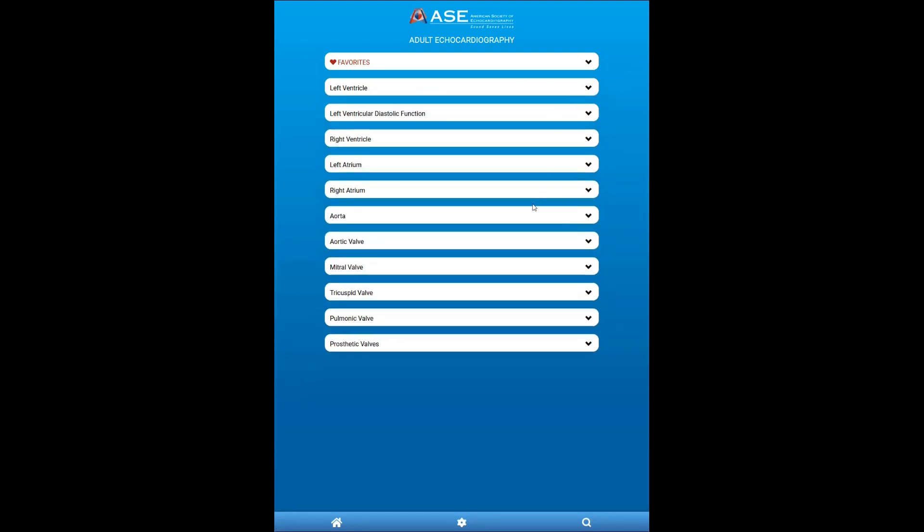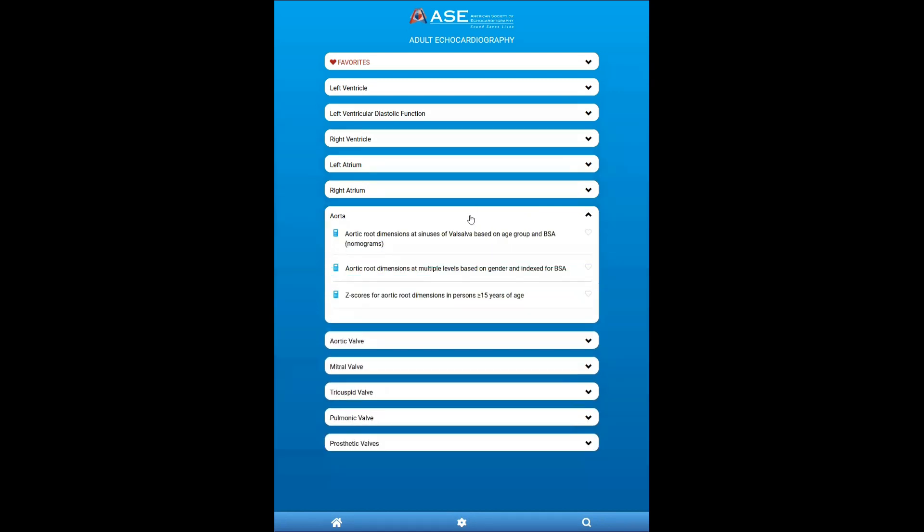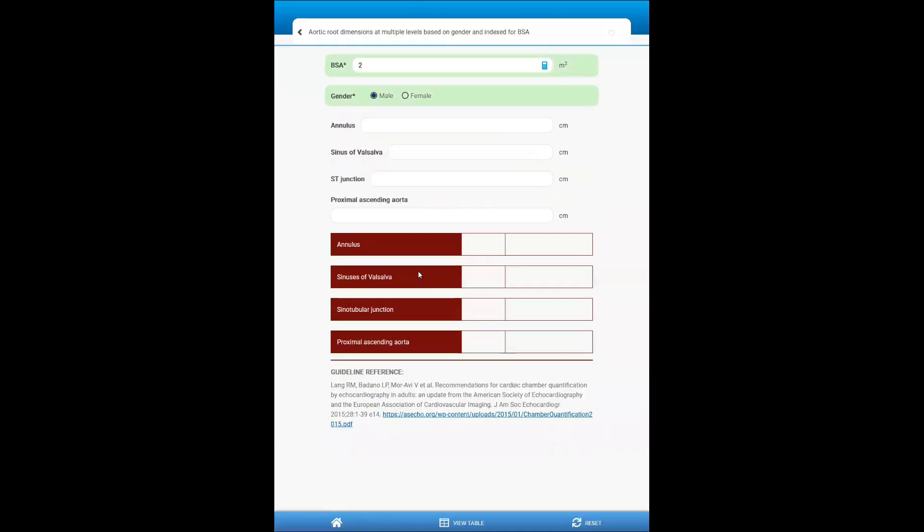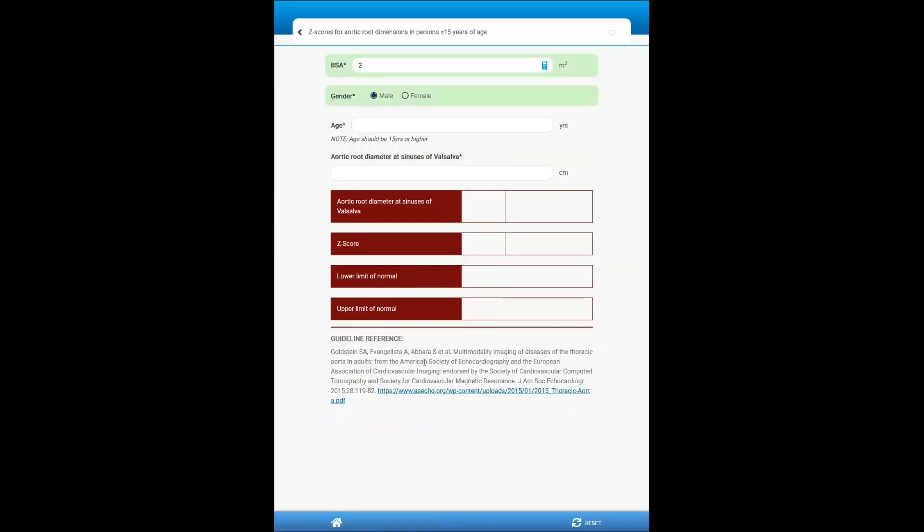One that is fairly innovative is the aorta, because as you may know, there are different ways of grading aorta dilatation. So we have incorporated all of the ASE guideline-endorsed methods, including the nomograms based on age group, the indexed values for multiple different segments of the aorta, as well as a Z-score calculator based on the multimodality imaging for the aorta guidelines.